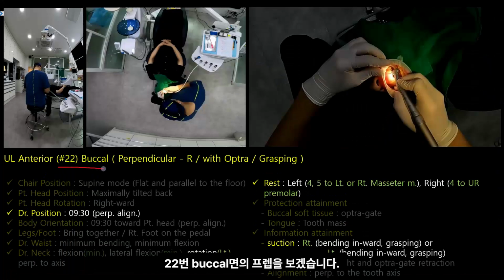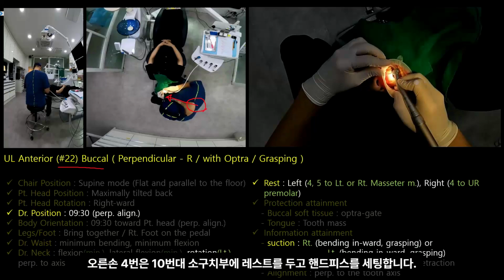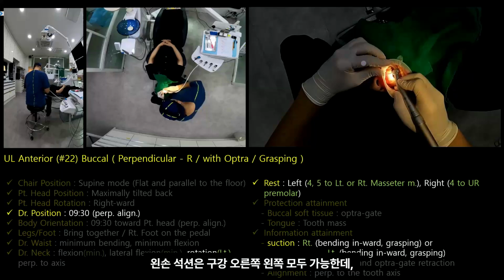Let's check tooth 22's buccal prep. The doctor's position is specifically at the 9:30 mark, directly facing the patient's head. Place the 4th finger of the right hand on the premolars in the number 10 quadrant for a rest, and then set the handpiece. The suction in the left hand.